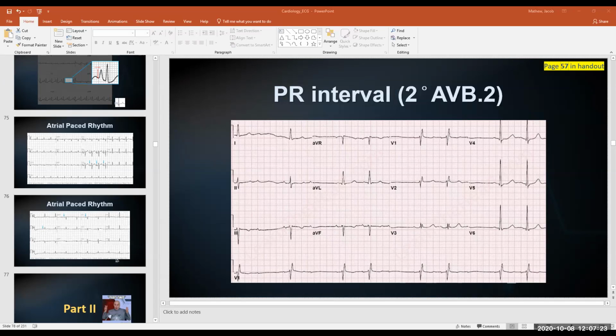You had a block on a patient earlier this year with you overnight. I did. Probably. I don't remember. My memory doesn't go back that far, Pat. So it's the dementia kicking in. So you can see that the PR intervals appear to be pretty goldfish. Is that the name of the patient? Or are they eating goldfish? Or do they hate goldfish? No memory. Goldfish don't have memory? Oh, okay. All right, I didn't know that. I thought maybe that was the name of the patient. I was like, I would have remembered that the patient's name was Goldfish.